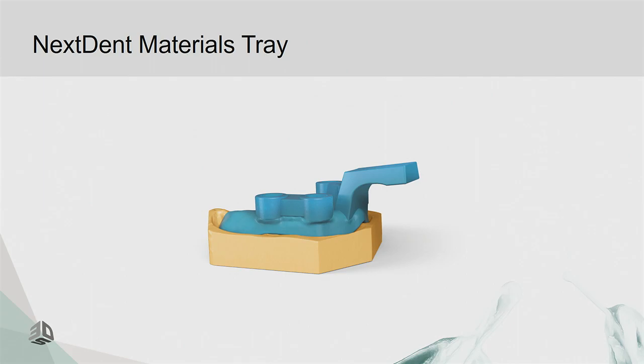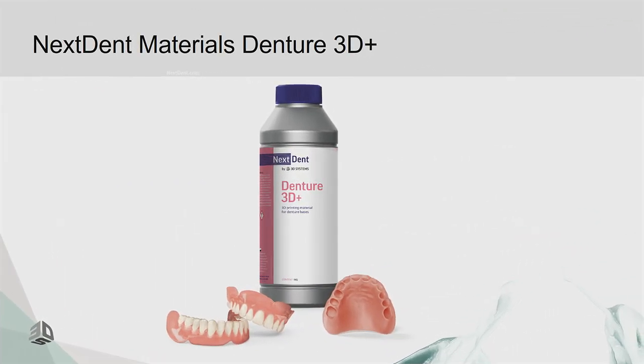Implant structures, there's a tool in there to perfectly align with the implant that you want to take your impression on top of. So now it gets interesting, I think.